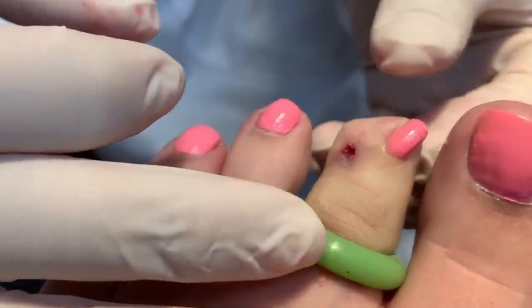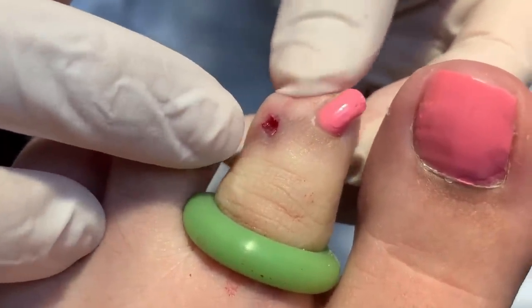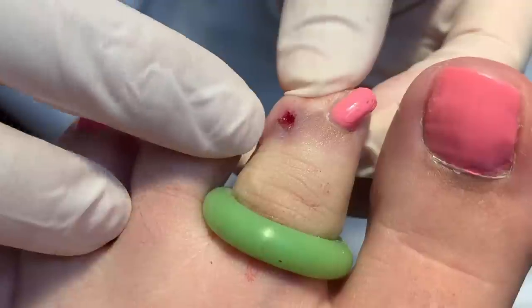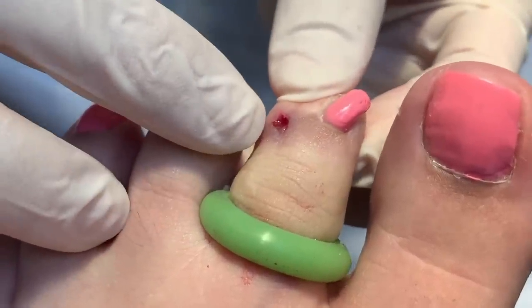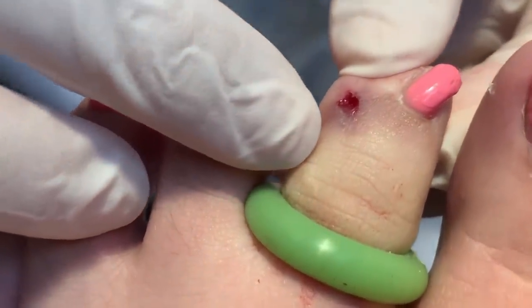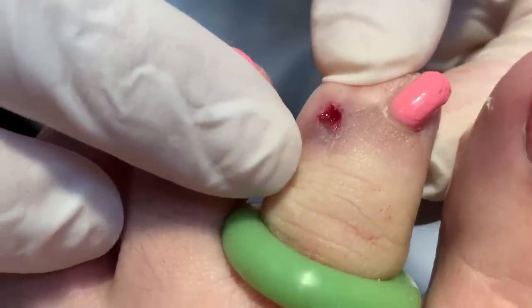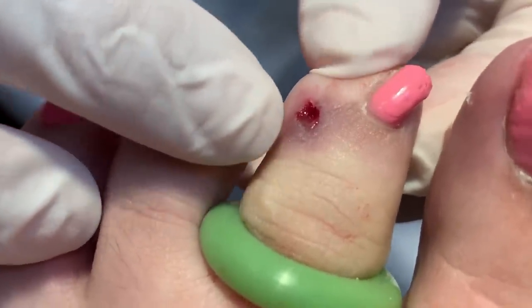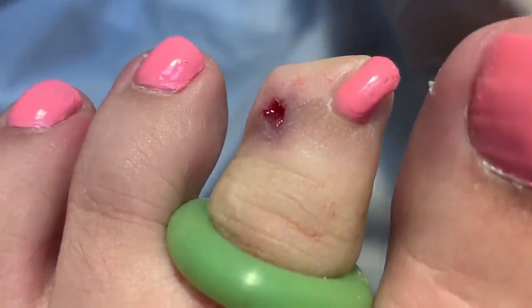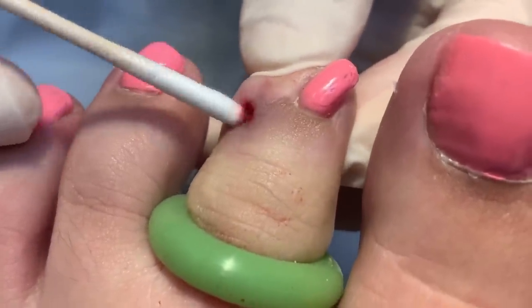So now we have this nail that had a previous surgery, and then the nail kind of re-grew here, so now we're trying to kill the root. But as you can see, this area is so small — that little nail is called a spicule. This is what happens sometimes when you do the matricectomy or cutting out the root: sometimes some of the root is left over, and then it regrows the nail, but they're so small. So usually what I use is a cotton tip like this one, but this won't even get in there too well.